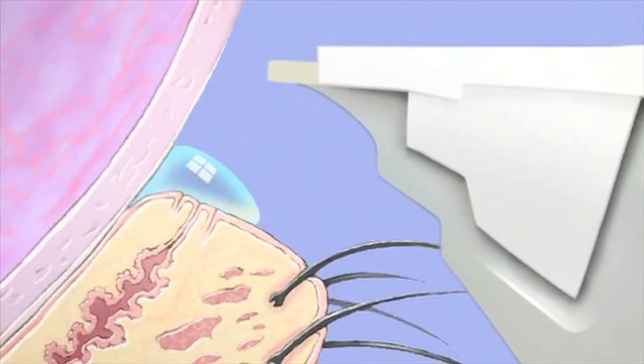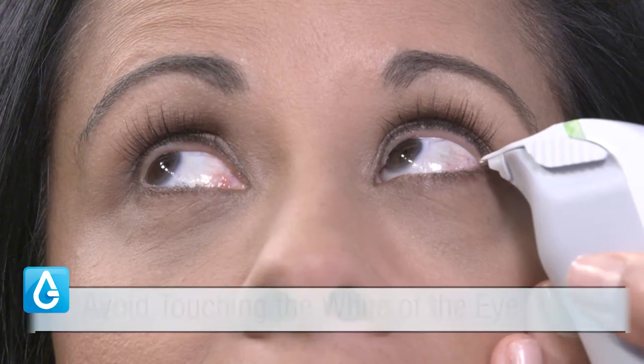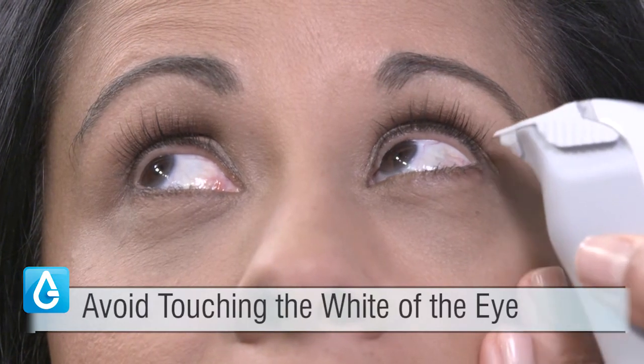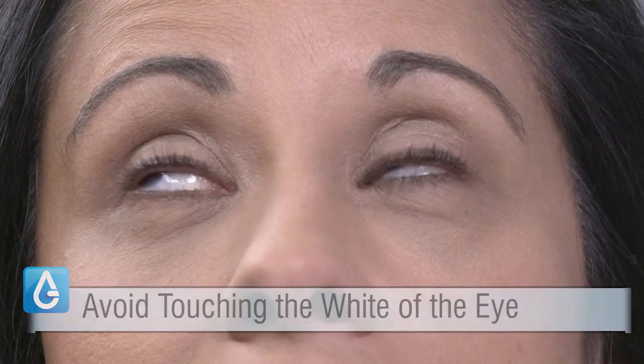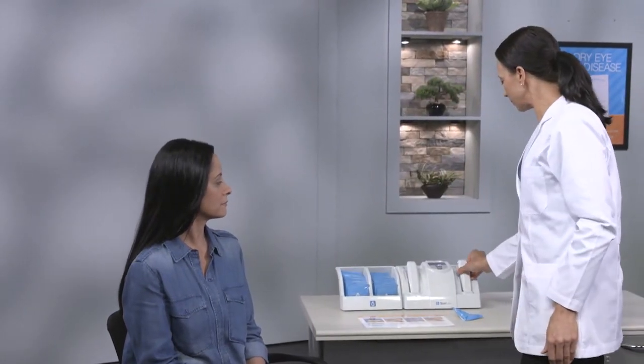Lower the pen until the bottom of the tip touches the line of moisture on top of the eyelid. The tip should actually come in contact with and touch the top of the eyelid, but avoid touching the white of the eye. Successful tear collection will be indicated by the beep of the pen and the green light going off.